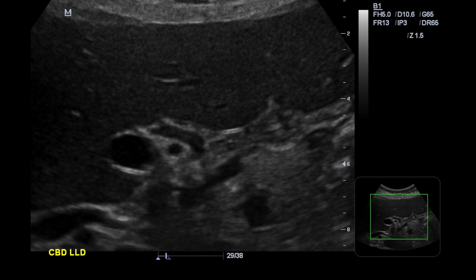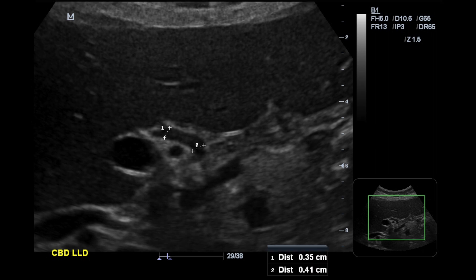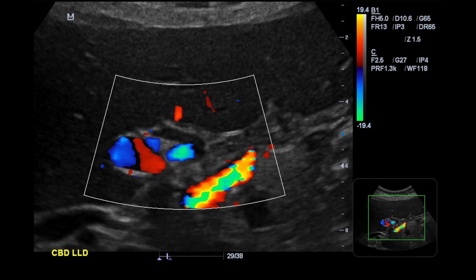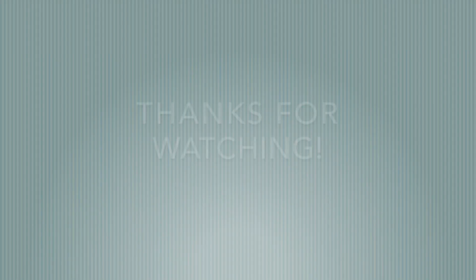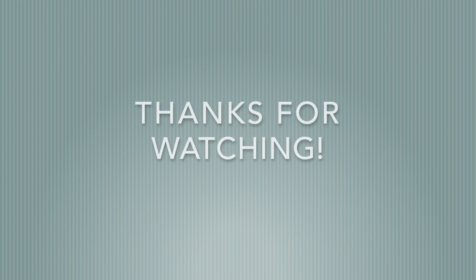In LLD we take the same three transverse pictures of the gallbladder neck, body, and fundus. We don't need to repeat the wall measurement or the CHD, but we do look at the CBD again — sometimes it extends much better with the patient on their side. On this patient the difference isn't huge, but we can still see it from the liver hilum to the pancreas head. We take another measurement and always use the largest CBD measurement on our report, then do another color Doppler image to prove it's the CBD. You can see how much more color there is in the portal vein in this image compared to the supine one.